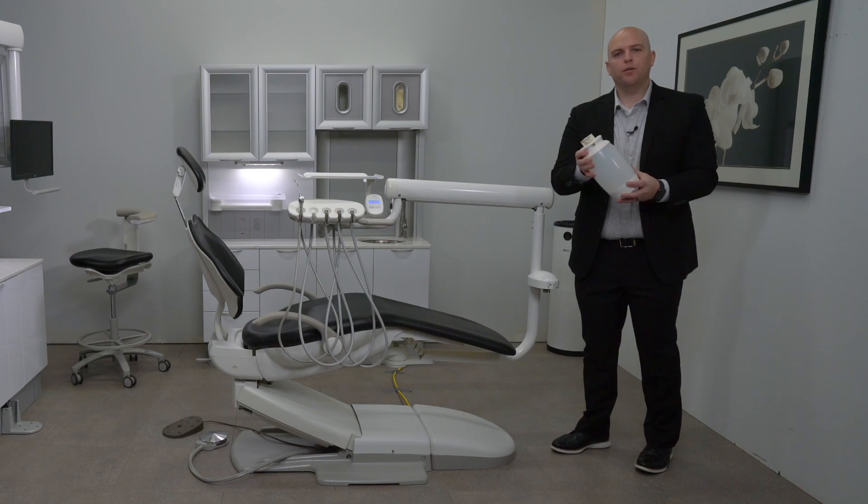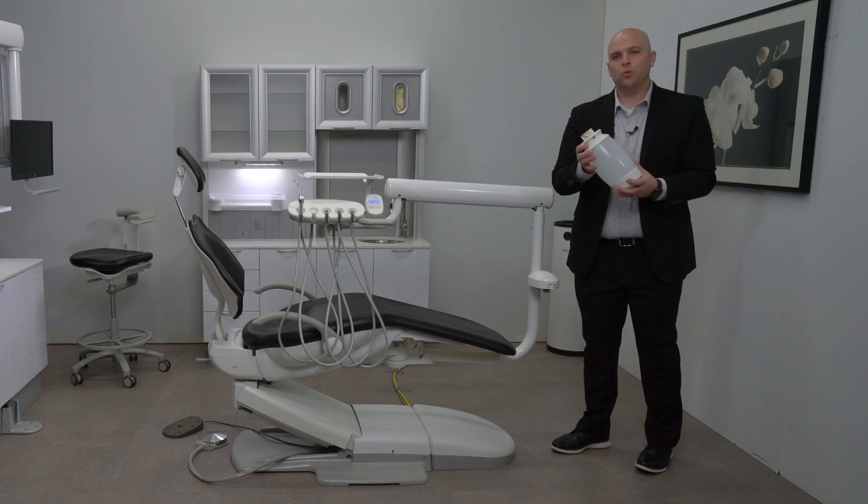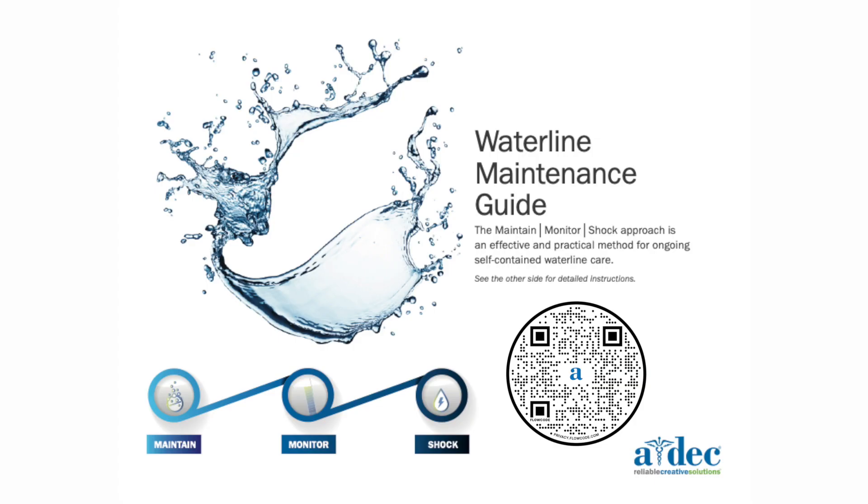When you fill the water bottle, be sure to add one tablet of ICX. Be sure to refer to the waterline maintenance flyer found online.